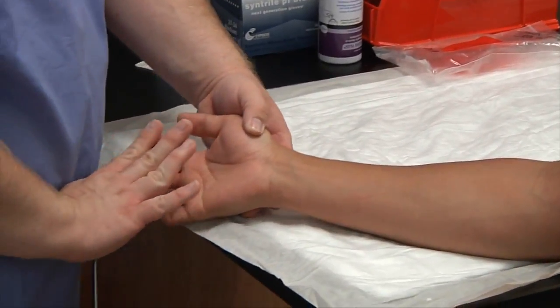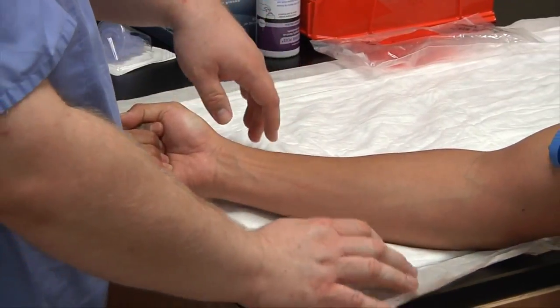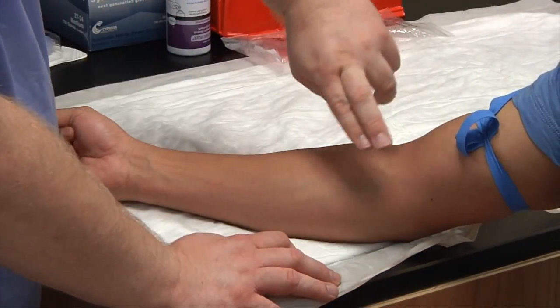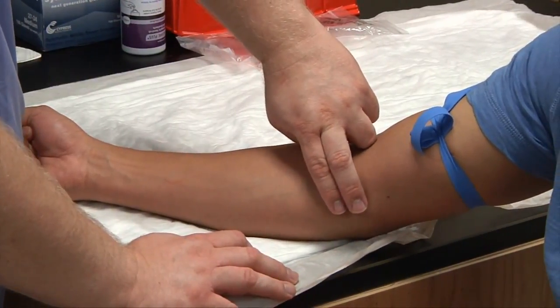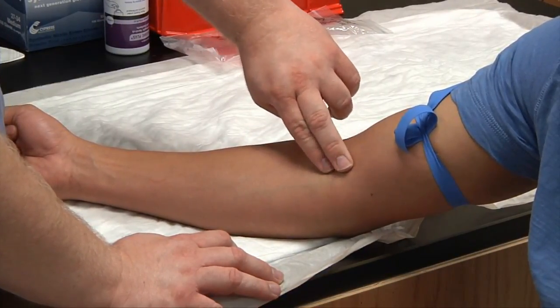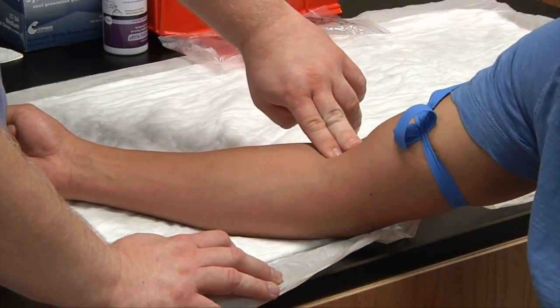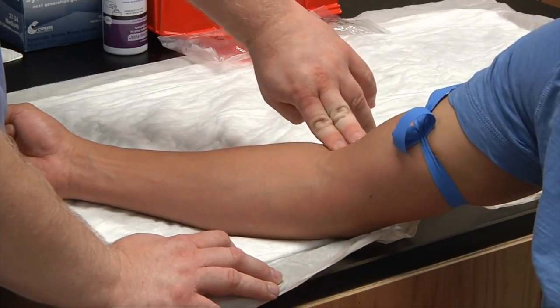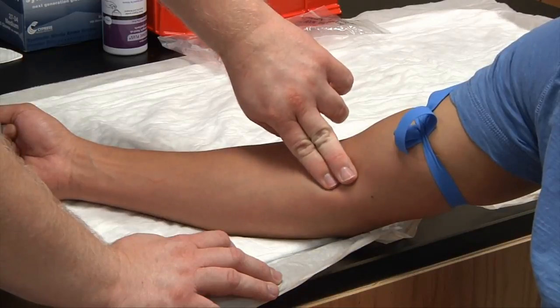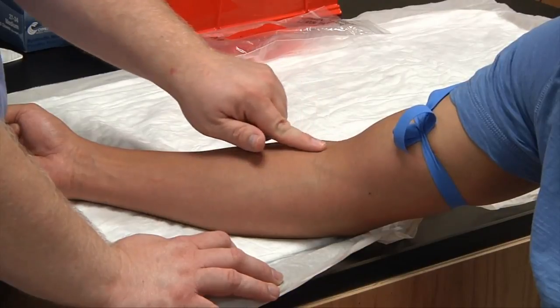Ask your patient to make a fist — not to pump their fist, just make a fist — and this will help in finding the veins. With the two index fingers of your non-dominant hand, start from one side of the patient's arm and palpate, pushing in and down, moving gently across. Your first sweep you're just seeing what your patient has, then pass through again to determine if you have a vein, artery, or tendon, and choose your selection site. With this patient, I'm going to go right here with this vein.